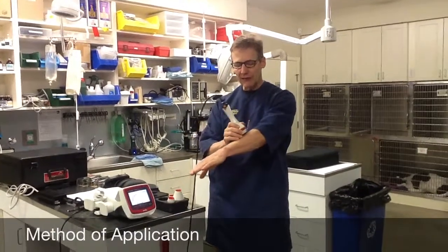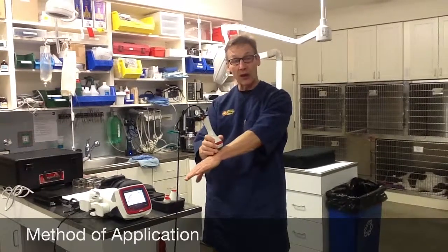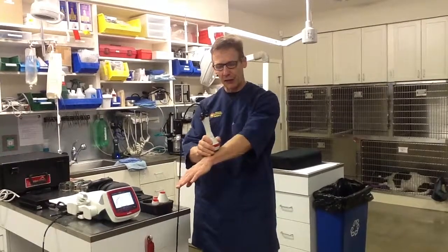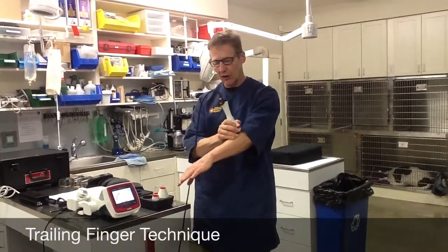The method of applying this is to move it at 1 to 3 inches per second — I like it closer to 1 inch per second. I like to have a finger touching the tissue that I'm treating. I call that the trailing finger method, so I'm checking in to see how warm the tissue is getting all the time.